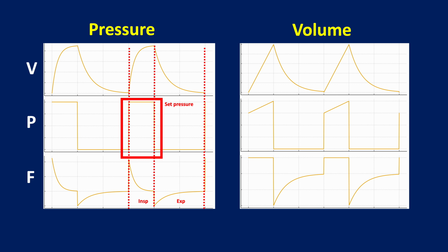So let's start at the beginning. What is ventilation? Ventilation is the process of moving air in and out of the lungs to enable gas exchange. We're going to outline the basics of mandatory ventilation modes, i.e. pressure and volume modes. This is a rather complicated topic, so we'll discuss both pressure and then volume modes of ventilation. Each graph will be discussed individually.